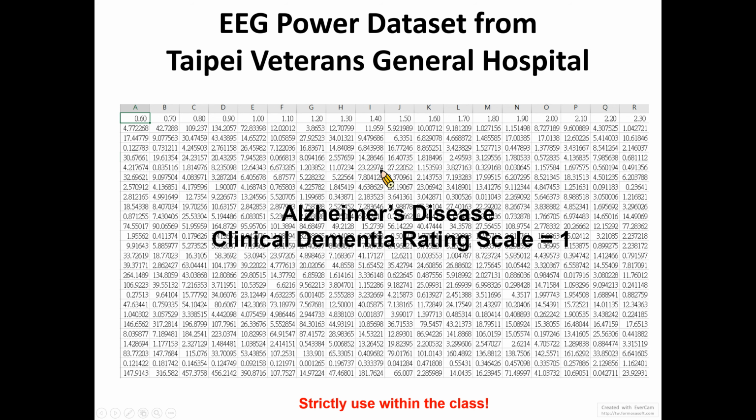And you might be wondering what this is all about, because you can classify the patients based on the questionnaire data. The other point is that you can also classify the data based on the EEG markers. As I said, the type of the data will determine the results of the clustering.